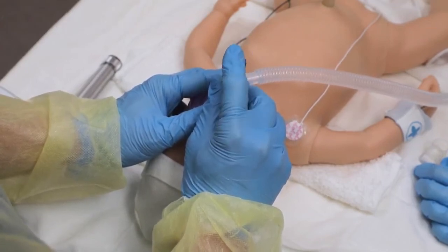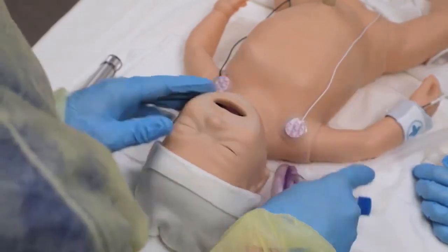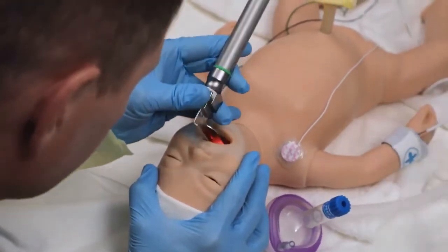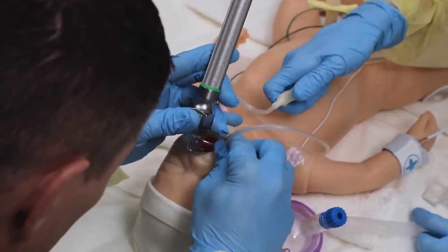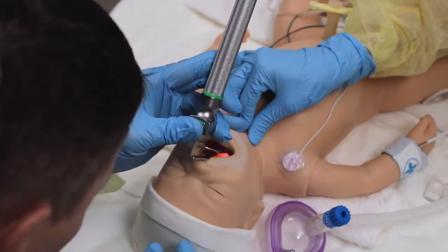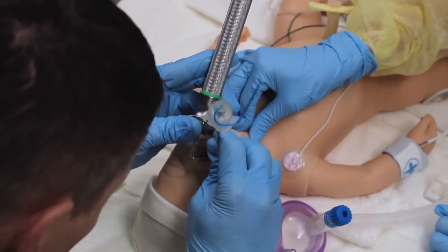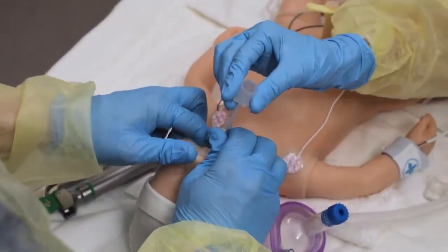Okay, Clara, we're going to intubate this baby. Is the equipment ready? Equipment's ready. All right. Can I get some suction? Suction. Thank you. Okay, cricoid pressure, please. Cricoid pressure. Good. I see the cords. Get the endotracheal tube. All right. Looks like it's through the cords. Removing your stylet. Okay.